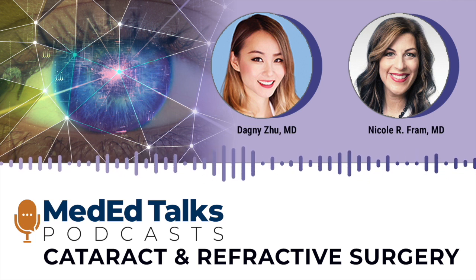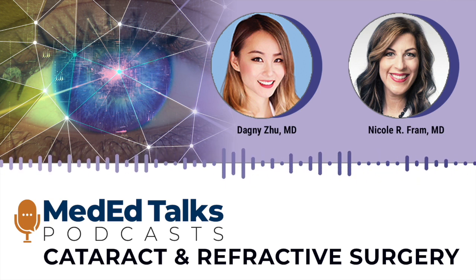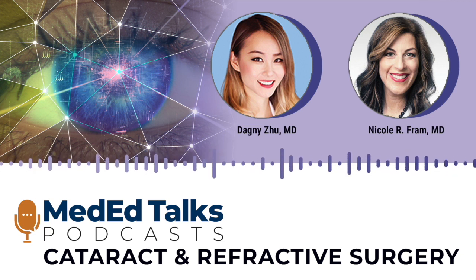I'm feeling really good. If it's way off the mark and I know that my lid speculum, it's a small eye and I opened it up too tight, if the corneal incision's overhydrated, if the patient can't fixate, I'm obviously not going to use it. And so I think a lot of the people that said, I don't need ORA, it doesn't work, are people that don't want to take the time to make sure that these parameters are set. And I would never choose ORA over my biometry if I had two formulas on two different biometers saying the same thing and ORA said something a diopter different. I would never switch to that.